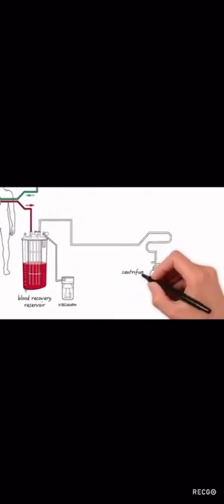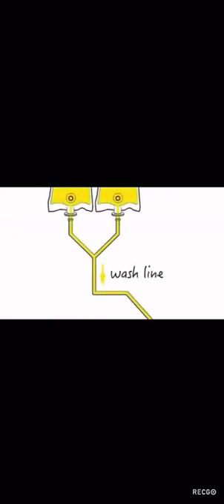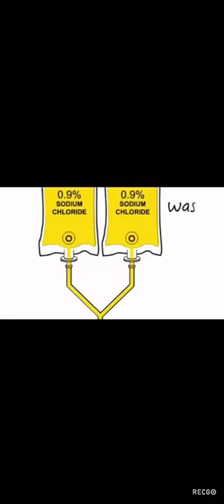The wash set consists of several elements: a modified Latham bowl, a pump loop and tubing organizer cartridge, the blood inlet line, the wash line, and the blood outlet line, a blood collection bag, and a waste bag. A bag of saline is also required. Processing happens in 3 phases: fill, wash, and empty.